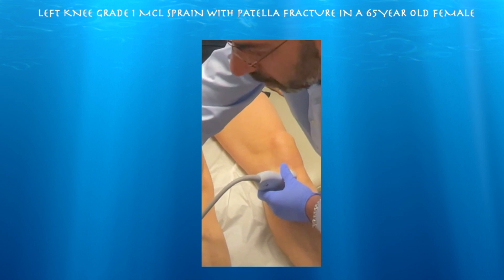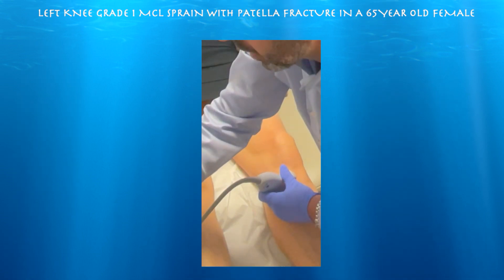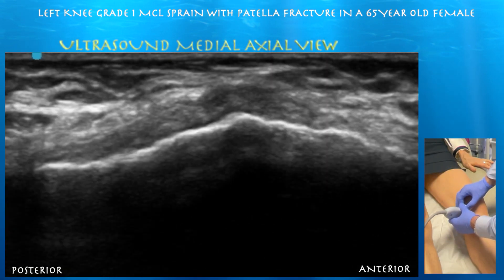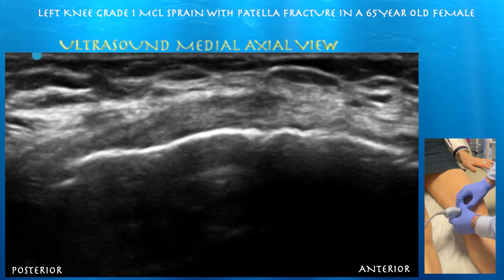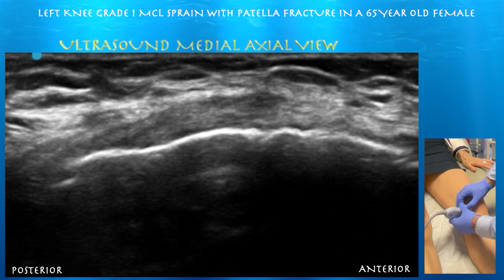Now we're going to go ahead and look at it in short axis. A little bit of hypoechogenicity, a little bit of thickening. Here you can see a little bit of hypoechogenicity on the superficial aspect of the superficial MCL, consistent with a low-grade sprain.